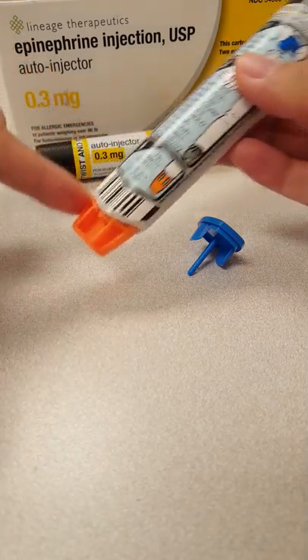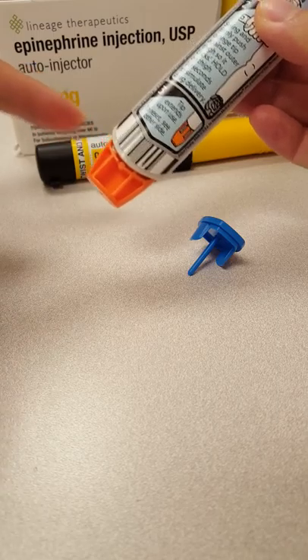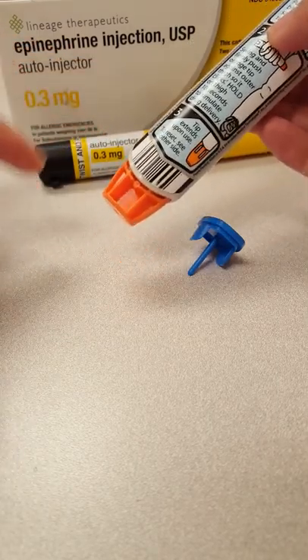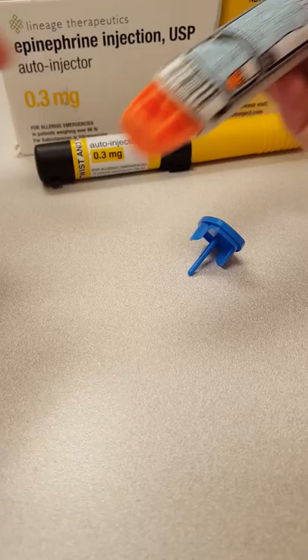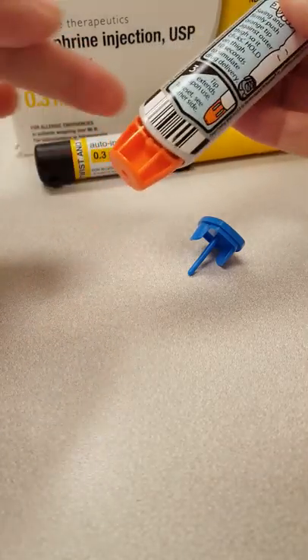This orange part is demonstrating the part where it will be red on the actual EpiPen, and then the needle would essentially eject as soon as you push this down into your thigh.